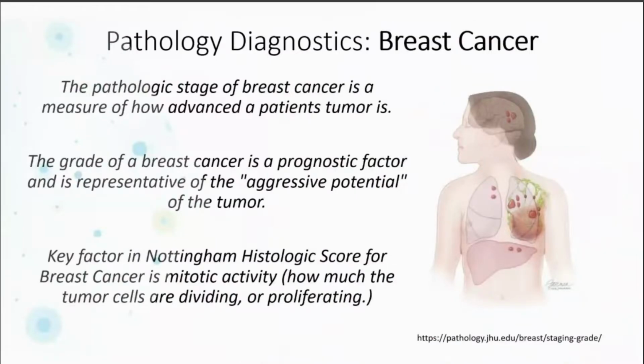So that was the overview of pathology and the state of digital pathology at a really high level. But targeting one particular clinical domain is breast cancer.